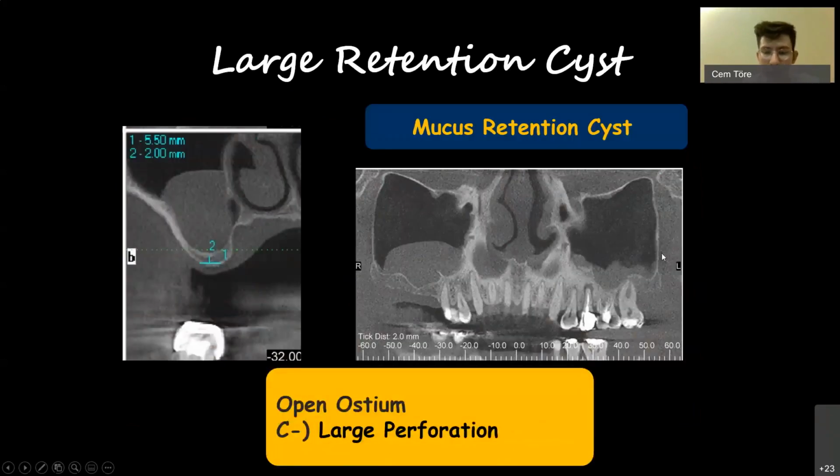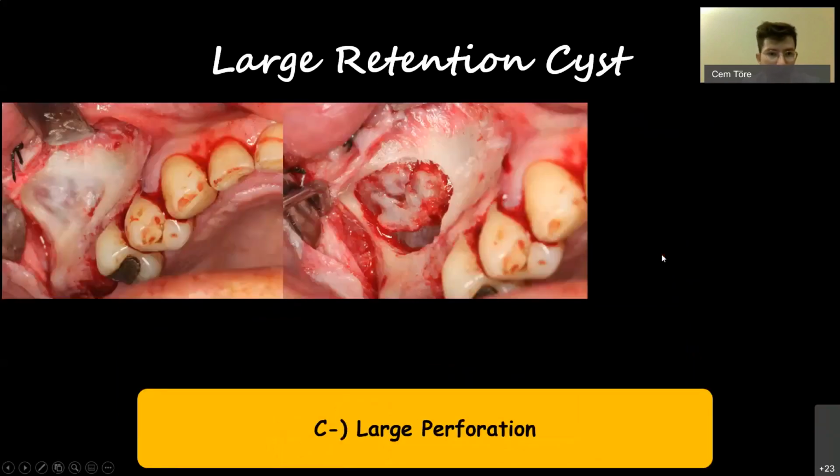In our sinus lift operations, we carry on no matter what. The operation is finished, the sinus is grafted, no matter how large the perforation is. We have a larger cyst here.